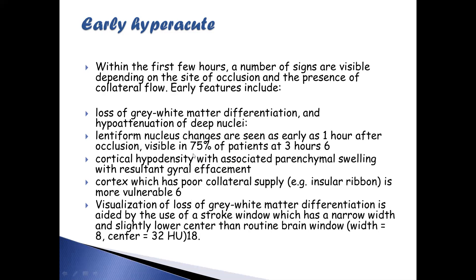Cortical hypodensity with associated parenchymal swelling results in sulcal effacement — there will be hypodensity, parenchymal swelling, and sulcal effacement. The cortex with poor collateral supply is more vulnerable. Visualization of loss of gray-white matter differentiation is aided by the stroke window, which uses a narrow width and slightly lower center than the routine brain window.